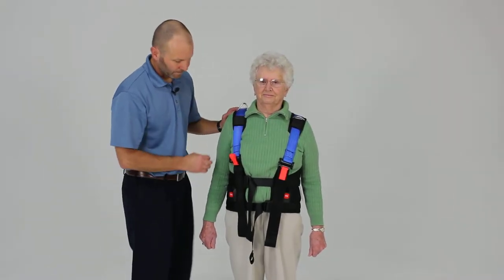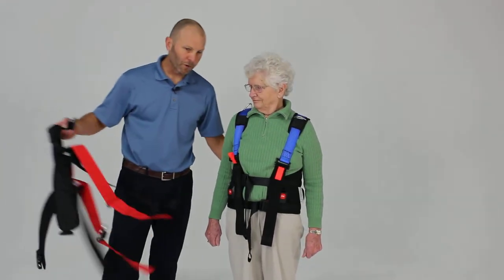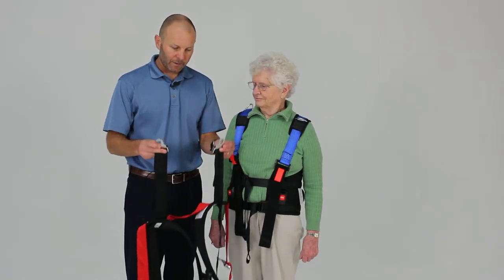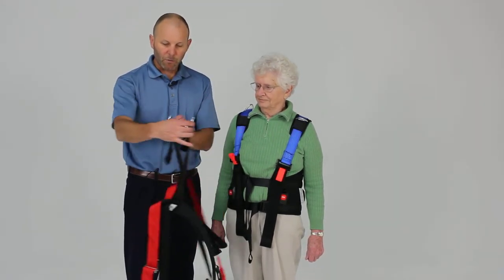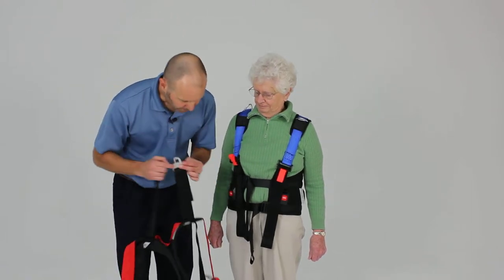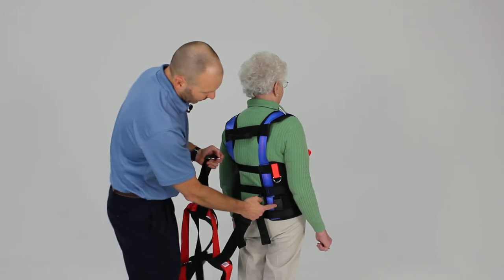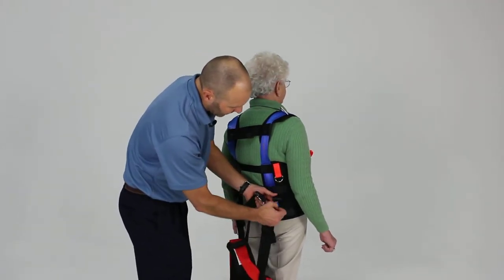The shoulder pad is also removable for washing. Now we're ready to apply the lower portion of the unloading harness. The easiest way to do this in a standing position is to first find the two male-ended seatbelt buckles that are attached to the black webbing. Hold them in position — they just hang in place. The two black buckles with the black webbing are going to attach to the buckles that have the black press area.